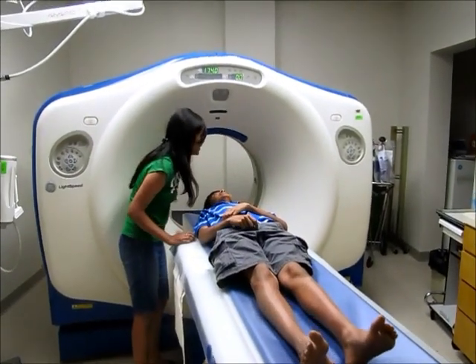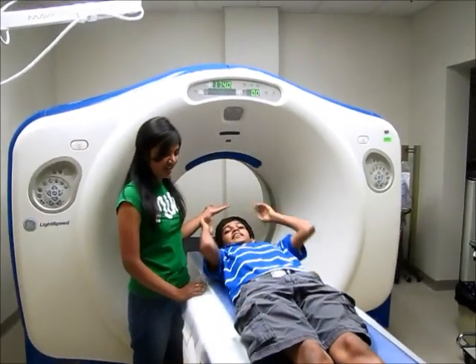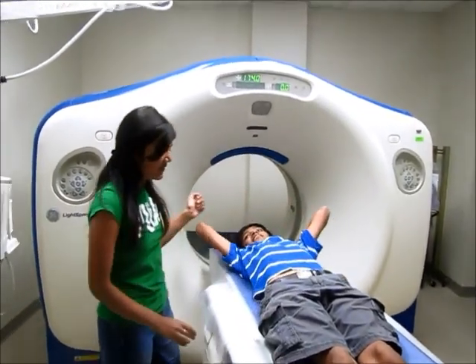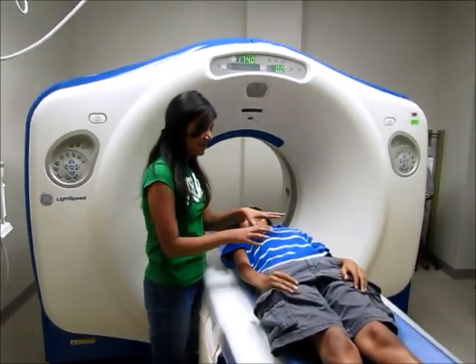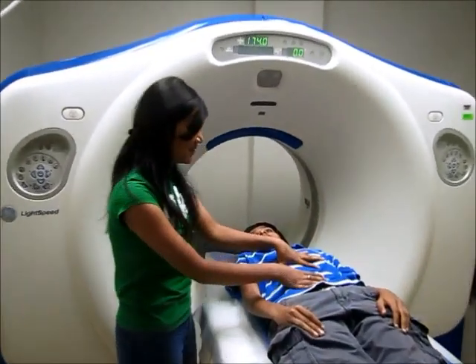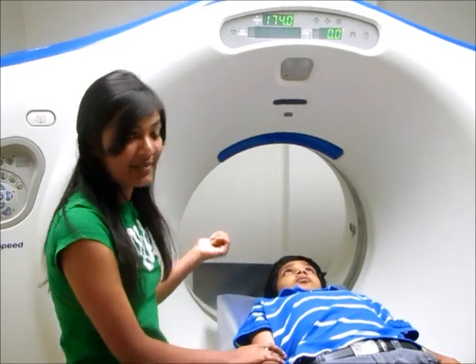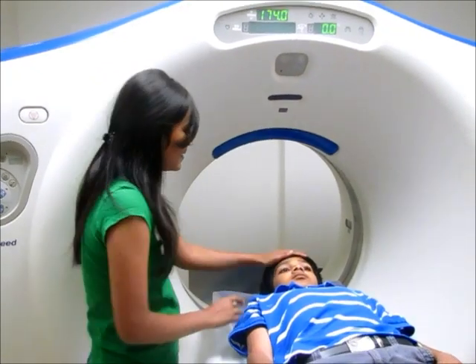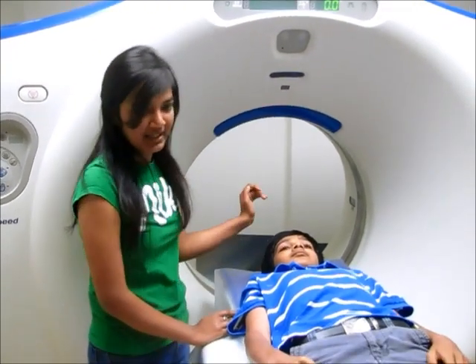This is like the camera. This is where it takes your picture. If you wanted to diagnose a stomach problem, then this much of your stomach would be in this part. And if you want to diagnose a brain problem, then your head would be in this part.